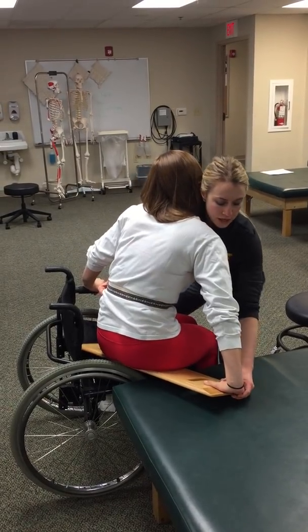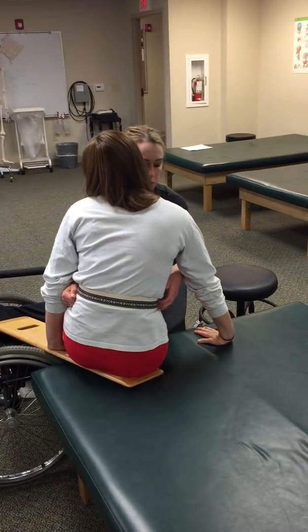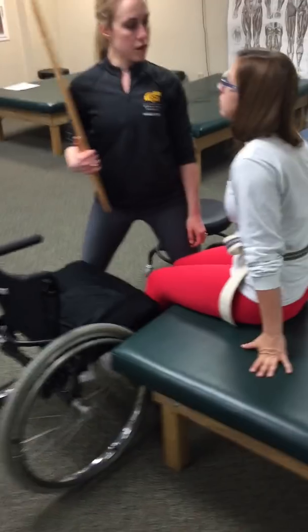And then I'm going to have her move her hand just to the edge. We're going to slide again. And then she's going to move her hand all the way to the table. And then we're going to slide one more time. And she's all the way over. And we take the transfer board out, and we are good to go.